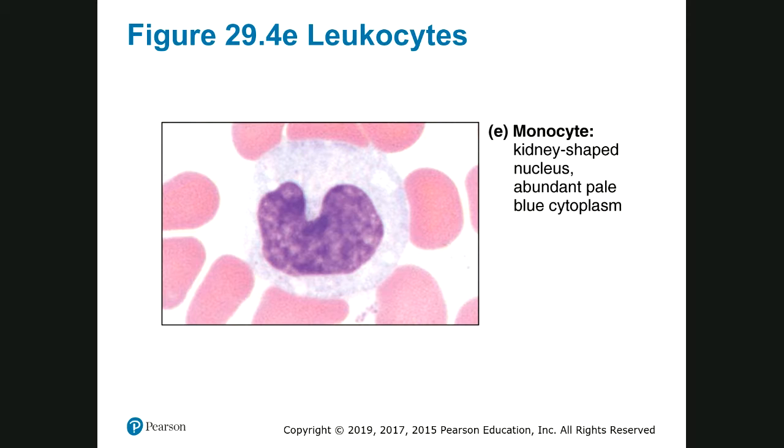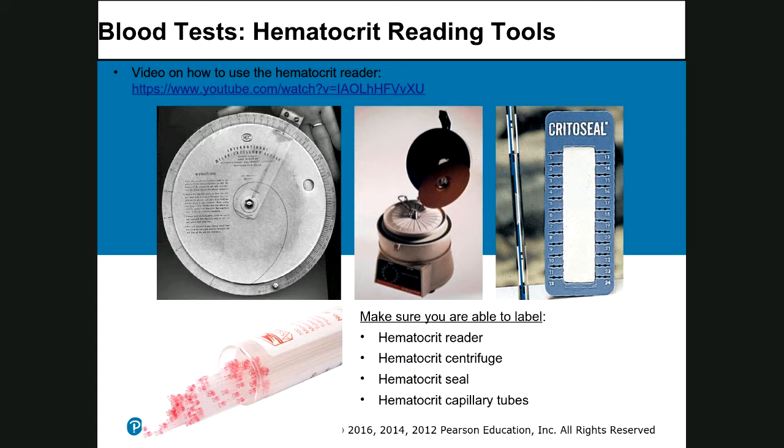You have the U-form or kidney shape, the monocyte. So you are going to be able, in the practical, when I give you any histology microscopic picture, to recognize which type of cell this is.